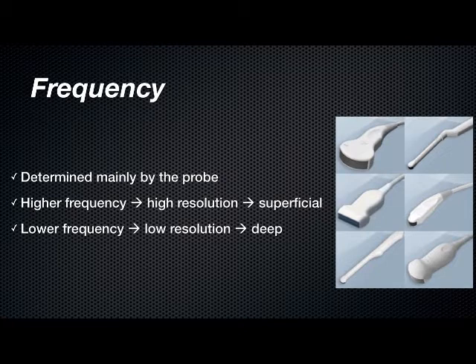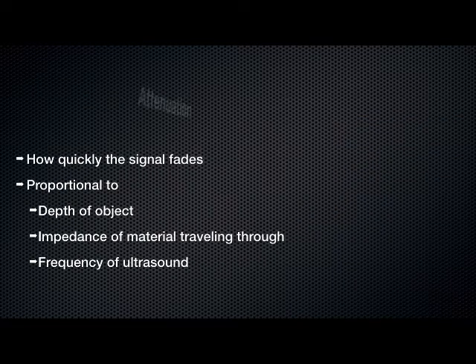Now, low-frequency probes are designed to go very deeply into the patient's body, and they're not going to give you a whole lot of resolution as far as the picture quality. The superficial probe, or the high-frequency probe, is much higher frequency and much more detail. It'll make a lot more sense when I actually get you guys practicing.